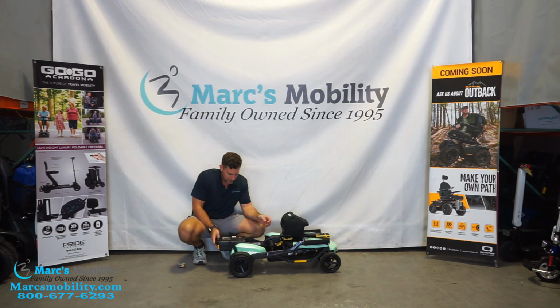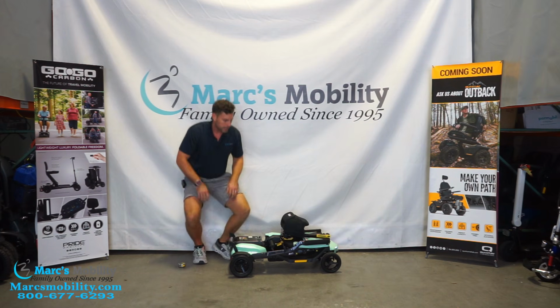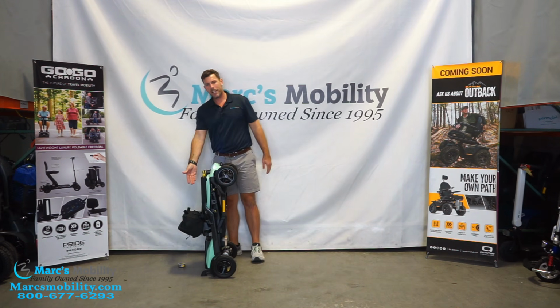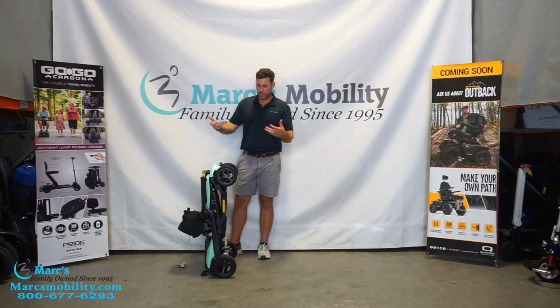The battery is going to be very easy to put back in. All you simply do is slide it in place and lock it back in with that yellow lever. Now, carry on, what that's going to mean is you are going to be able to stand this unit up as such. Do make sure your front basket is secured in place and zipped up so that your things don't flip out when you flip this up.